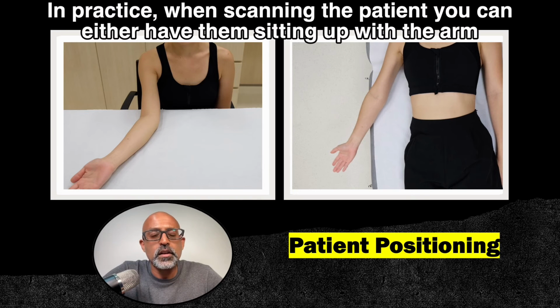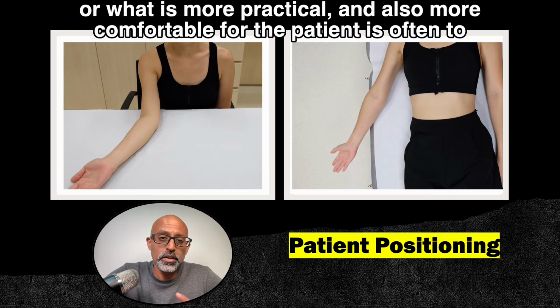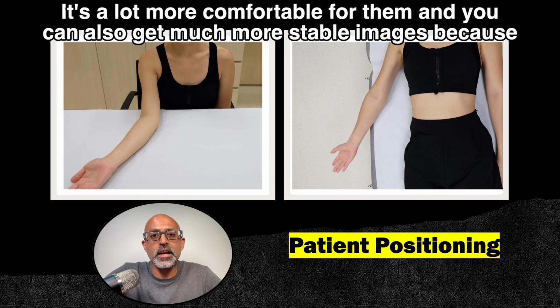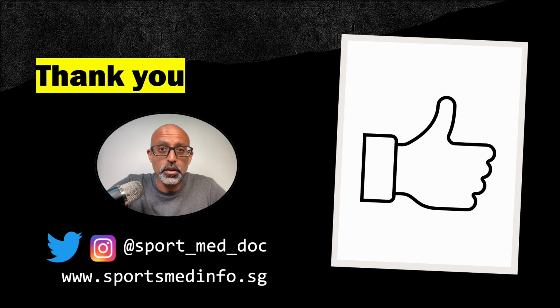In practice, when scanning the patient, you can either have them sitting up with the arm resting on the examination couch, or what is more practical and also more comfortable for the patient is often to have them lying supine, with the arm in a supine position and the anterior aspect of the elbow exposed. It's a lot more comfortable for them, and you can also get much more stable images because there's less movement of the elbow.